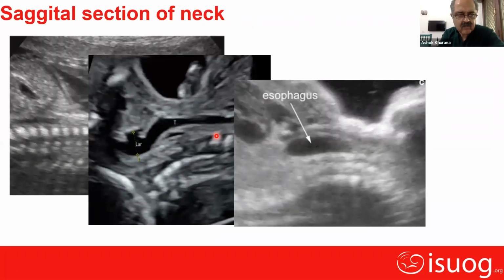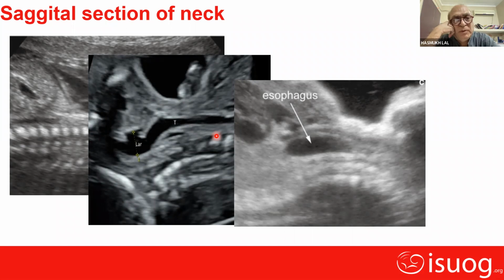So this is in case of atresia or obstruction. Rama, please comment. Yes, sir.